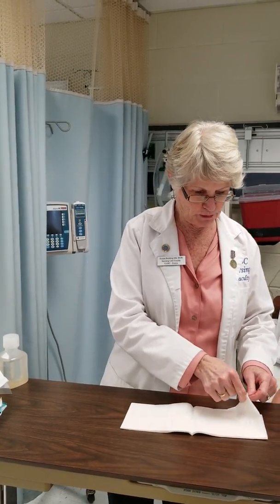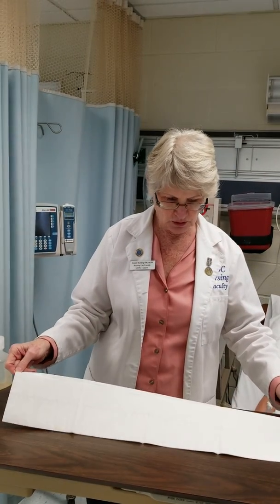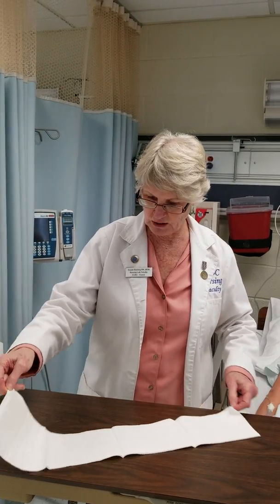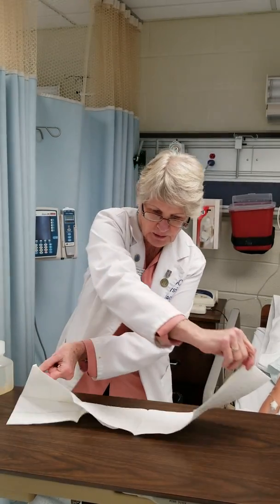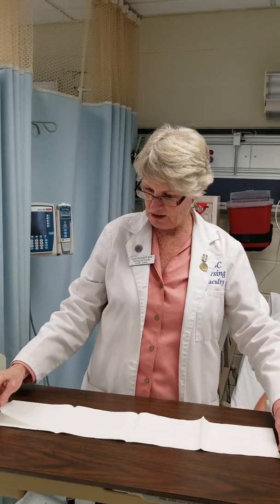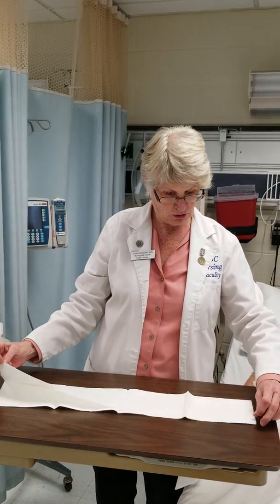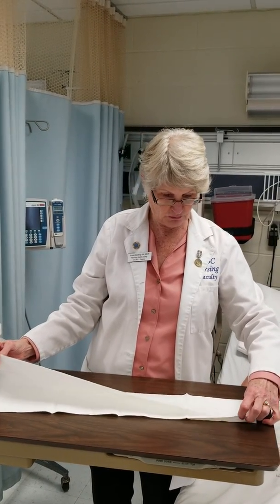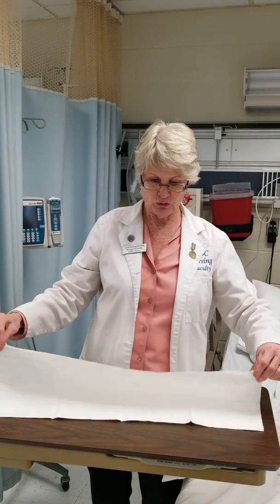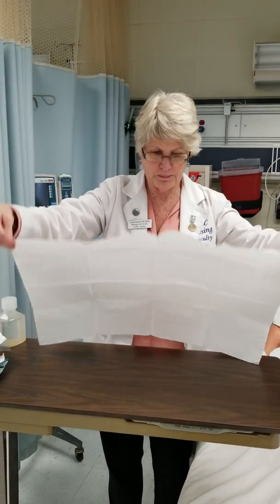Then I will open up my drape all the way with the closed seam facing me. So I want it to actually be the other way. Okay. I will grab it now on either edge. This is the side that will be facing down on the table. So I want to always make sure I have a 1-inch border when I pick up my towel. So I'll lift it up and drop it down.